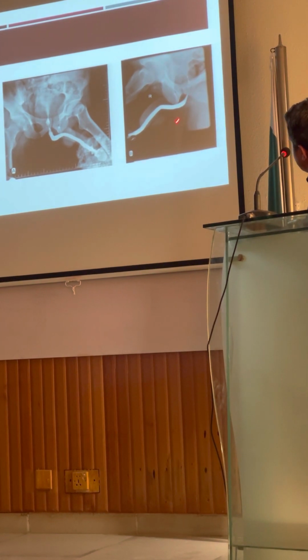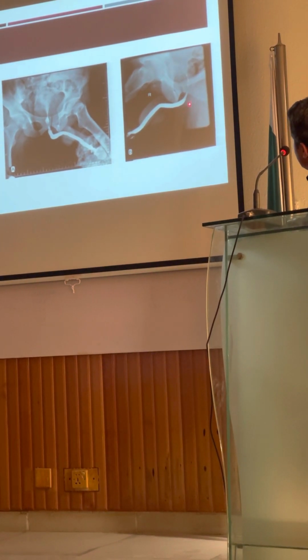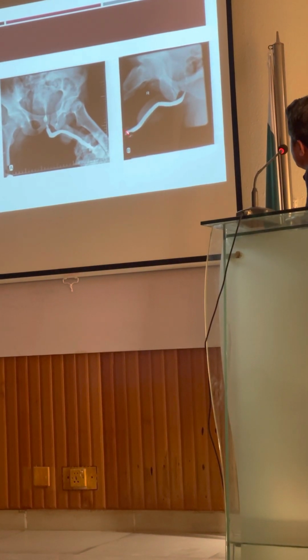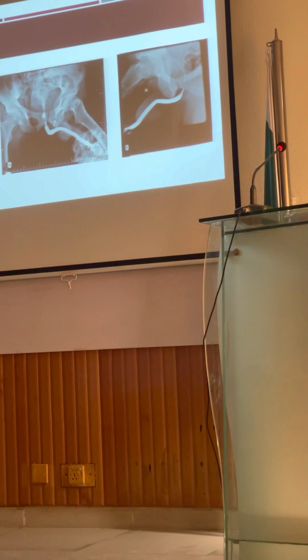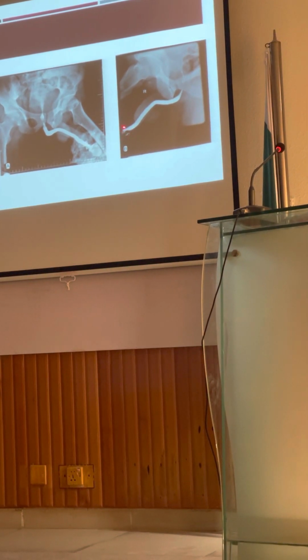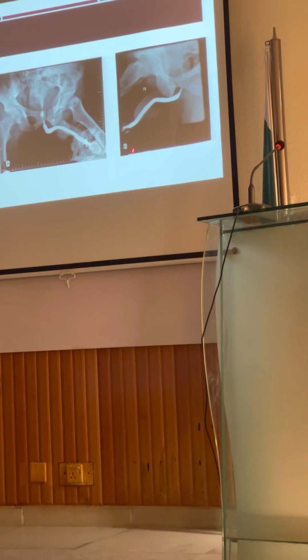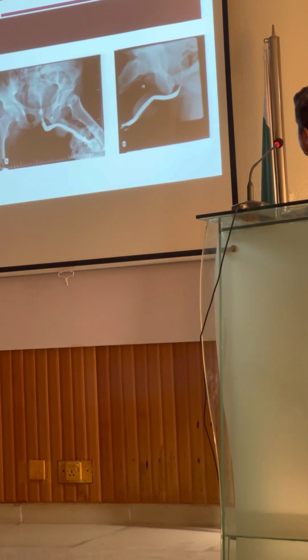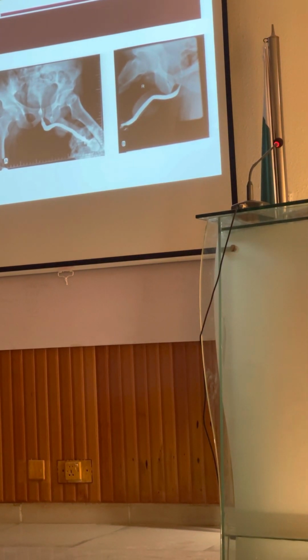And then this is another normal urethrogram, which is a retrograde urethrogram. We can see here the tip of the catheter, which is introduced here. After the injection of contrast media, the urethra is clearly demarcated. This is the penile urethra, then we have the bulbar urethra, the membranous urethra, and the prostatic urethra.